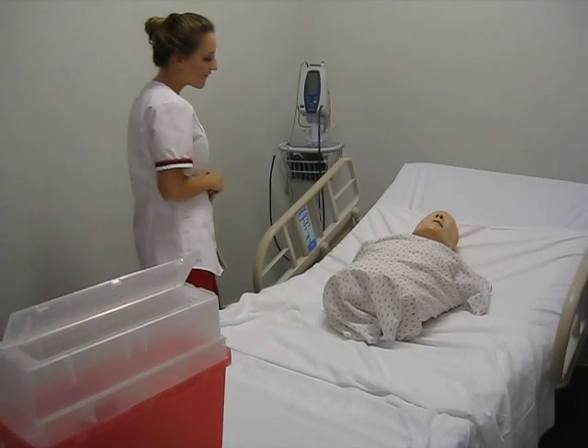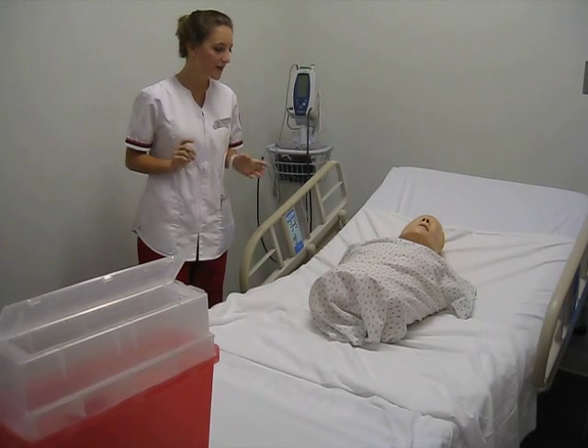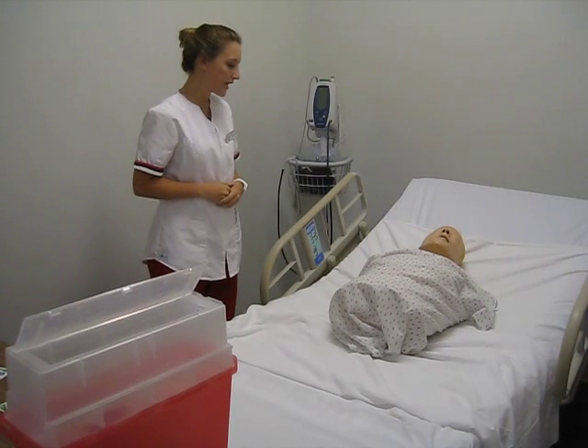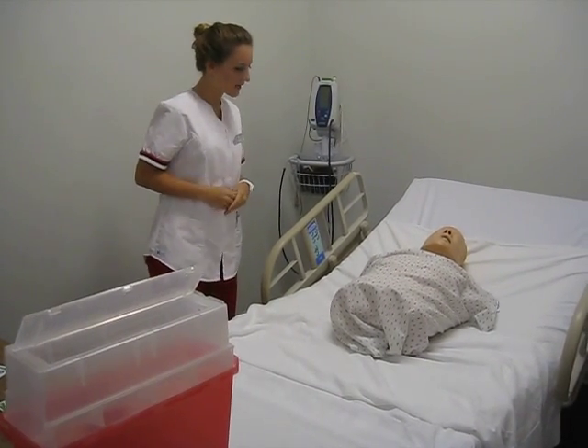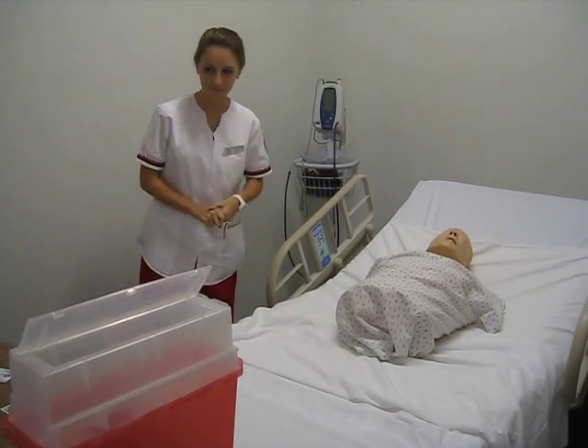Do you have any allergies I should know about today? You do not? Great. I'm going to go ahead and wash my hands. Today we will be doing a few injections — we're going to do a subcutaneous and an intramuscular injection. It should only take a minute.